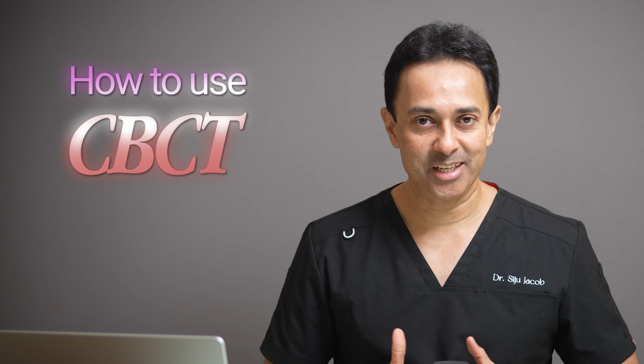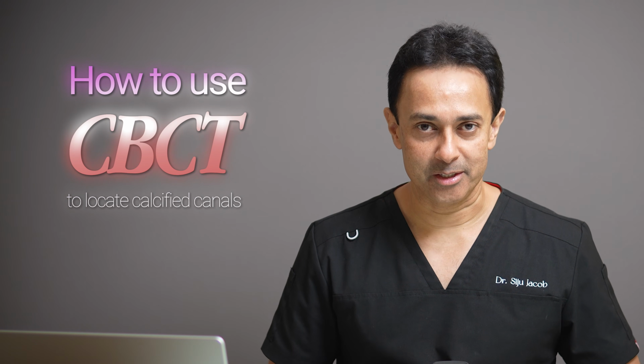This week, we're going to talk about how to use CBCT as an aid to locate calcified canals.